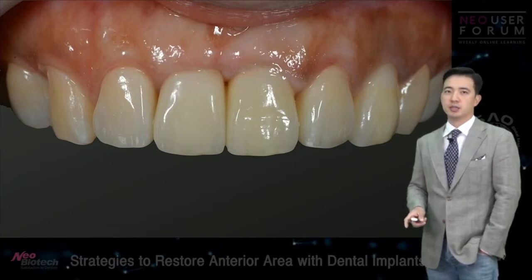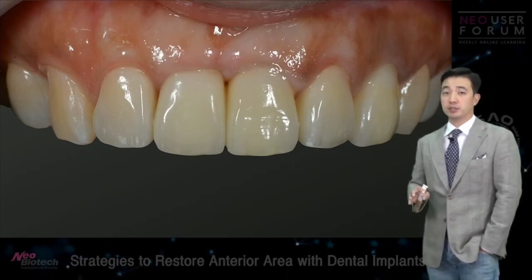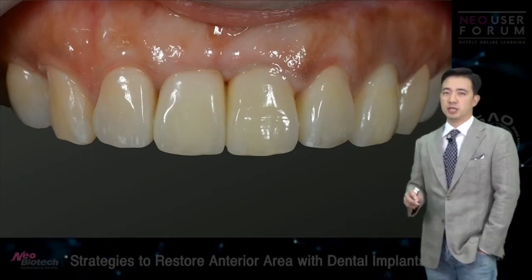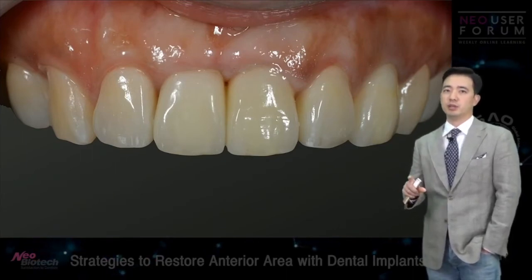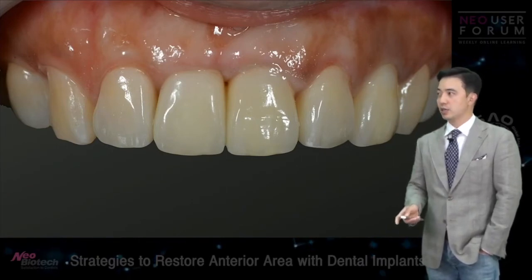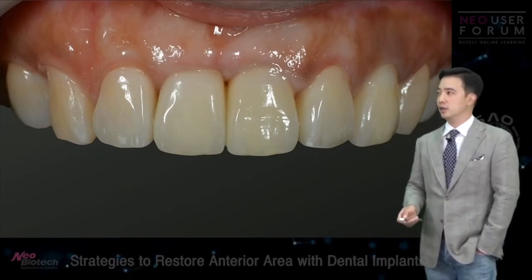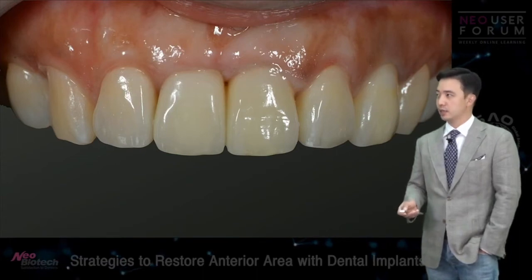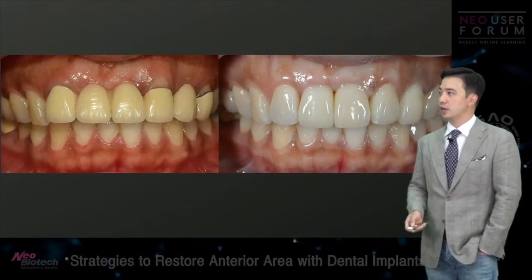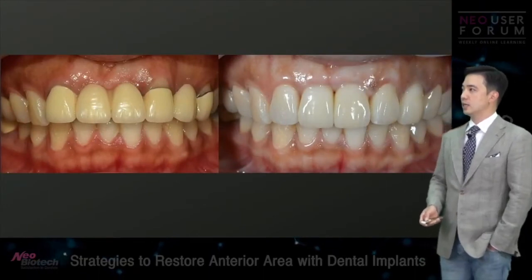So what I think is, the cold cure acrylic provisional restoration, the surface of it is very porous and the soft tissue doesn't like it. But with the zirconia surface, we kind of gained the soft tissue back. So this is how we started, and this is how we ended.